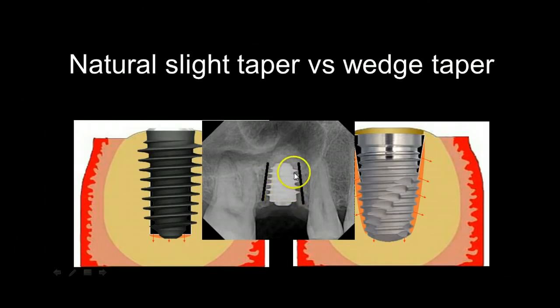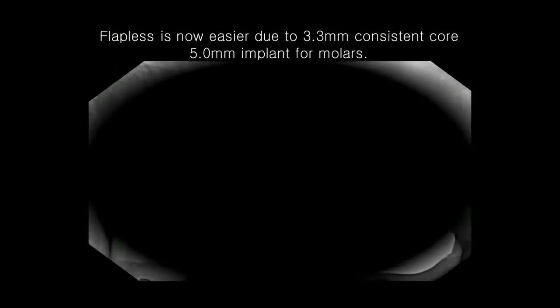It's an Anyridge, as you can see. But it's really not, because of the core being tapered, you envision the implant being tapered, but it's really not that tapered. When you take into consideration the width of the threads, again, it's really not that tapered. It's a small taper to it, yes, okay? But again, having that lack of taper actually adds more to the surface area, so the thread design actually adds a ton to the surface area of the implant.